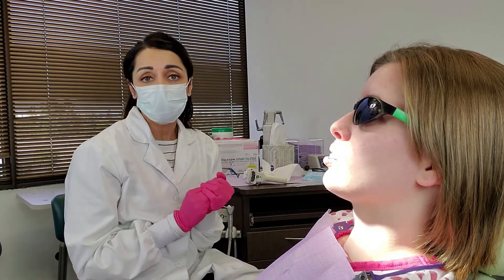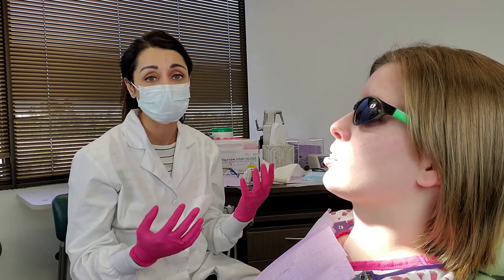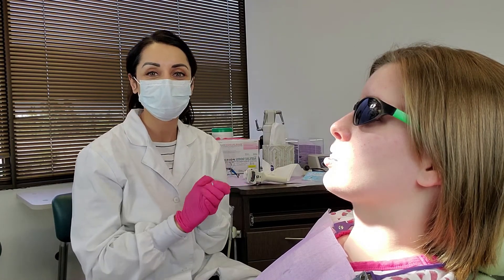What I do is oftentimes ask the lab to send me back the mounted models and the bite, just so I can verify that everything was done exactly how I want it. It might sound nitpicky, but I just want to make sure I'm doing the best treatment I can for my patients.